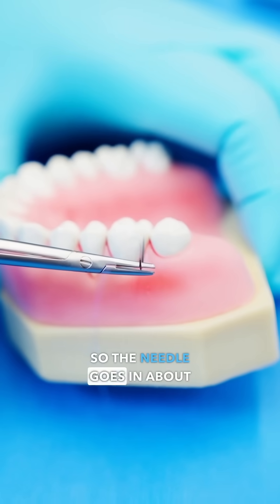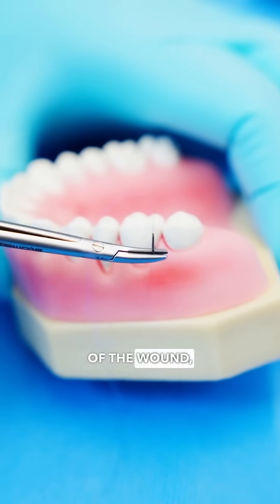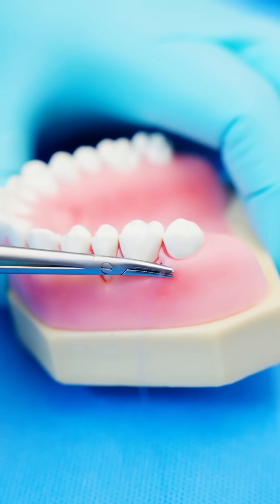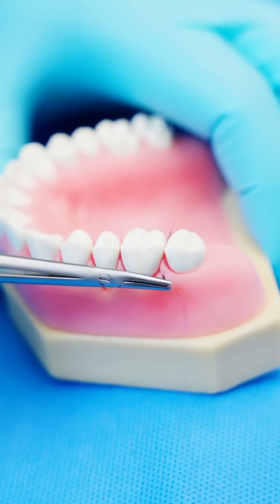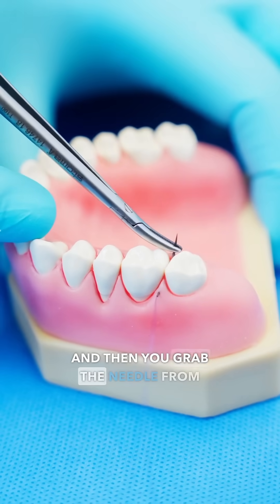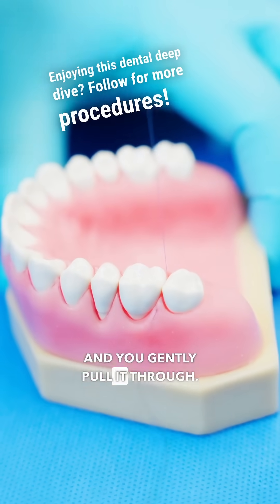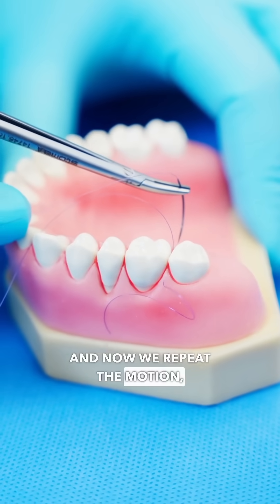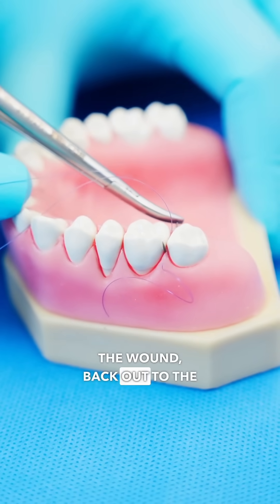The needle goes in about two or three millimeters from the margin of the wound and then it's gently turned and it exits on the other side. Then you grab the needle from the other side and gently pull it through. Now we repeat the motion, going from the inside edge of the wound back out to the other side.